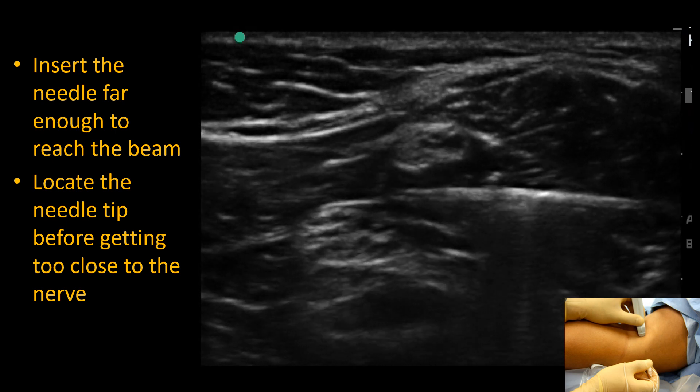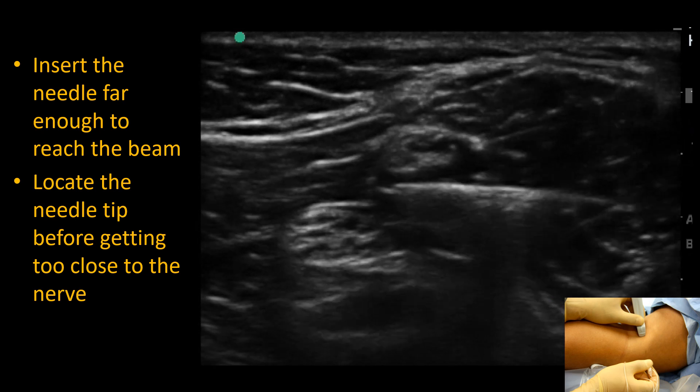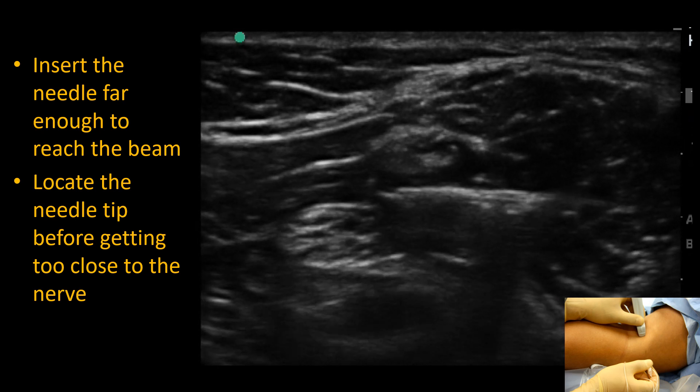We can see local anesthetic spreading around the common perineal nerve. The question now is whether the needle tip needs to be repositioned to ensure spread around the tibial nerve.